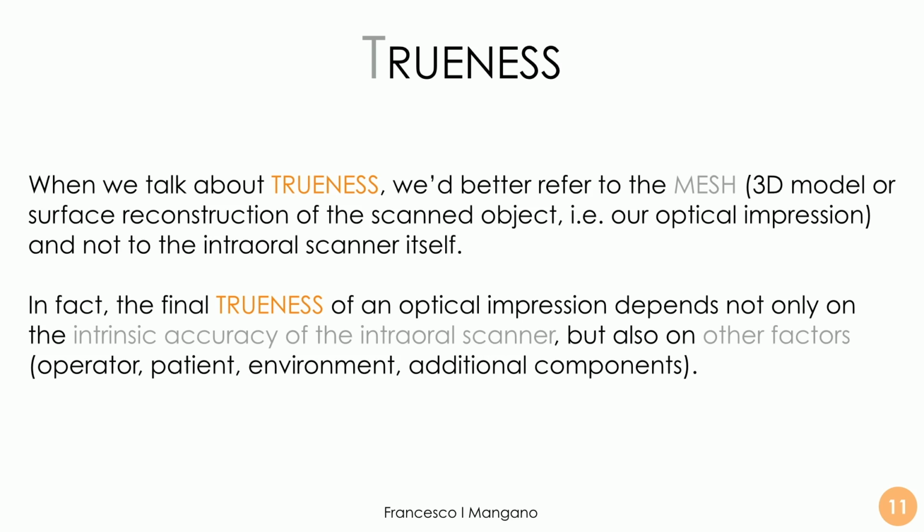There are also other factors, for example the operator: the experience of the operator and the scanning strategy are very important. Also, patient-related factors are quite important, for example the number of remaining teeth. We all know that a completely edentulous patient is much more difficult to scan than a dentate patient.